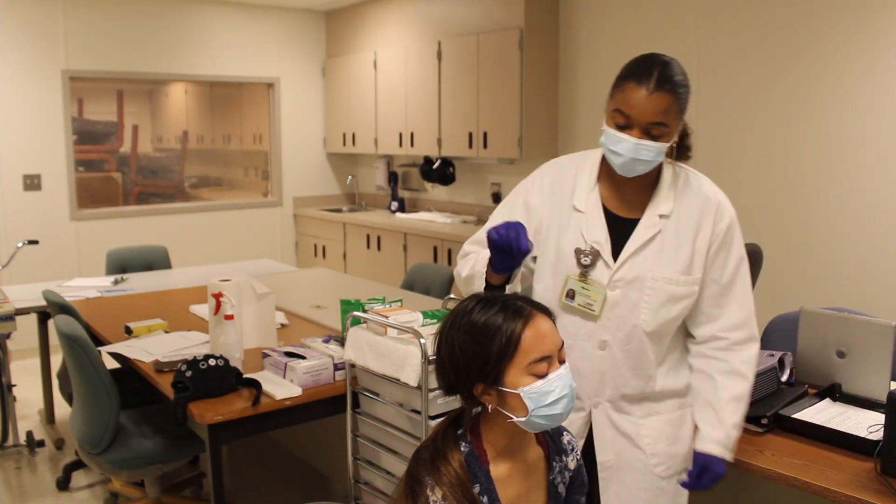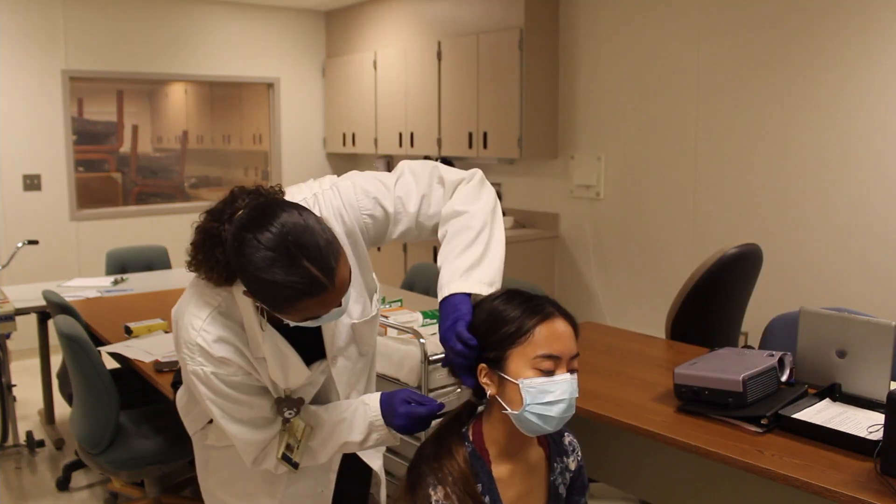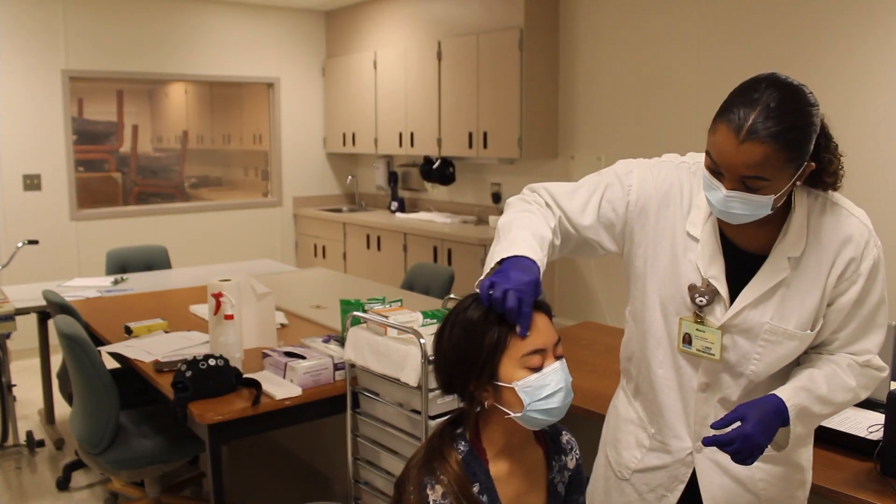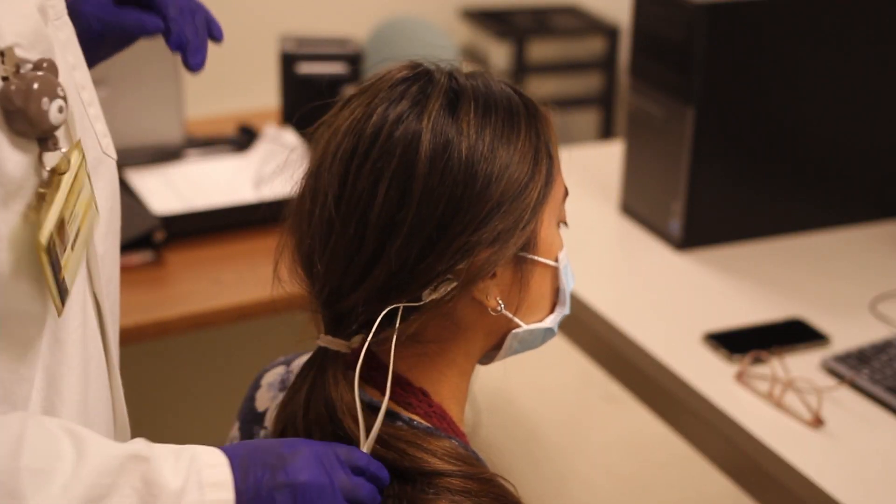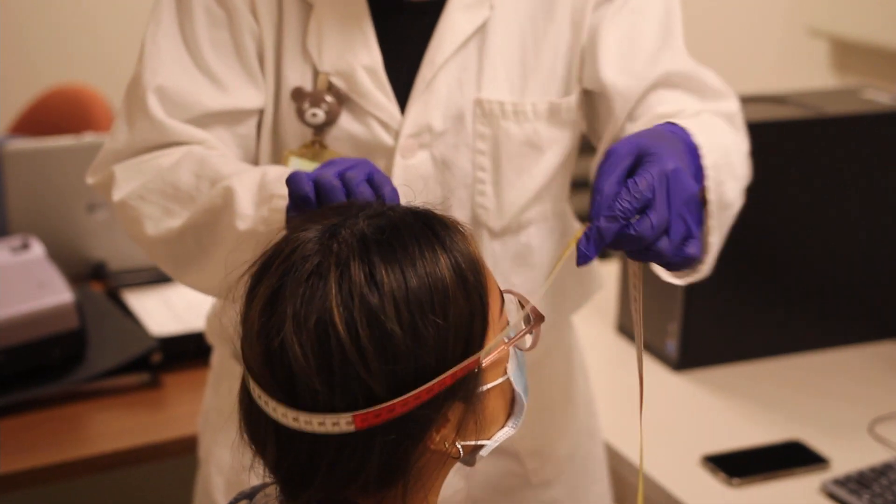The capping procedure begins with cleaning off areas of your face and head and placing stickers that will be used to measure EEG waves near your eye and behind your ear. We will then measure the size of your head to find the best cap for you.